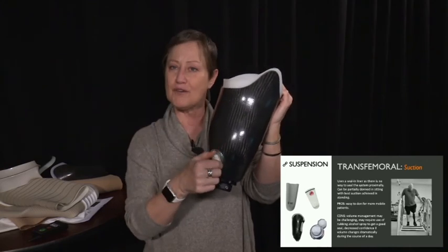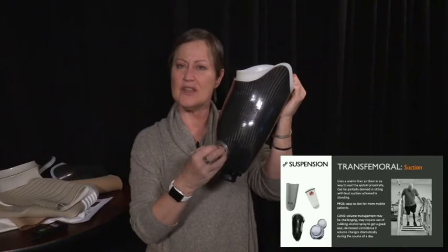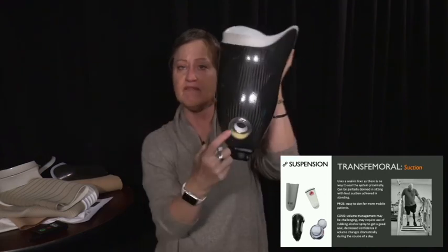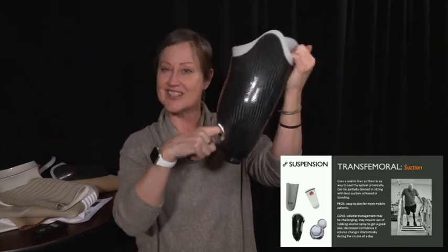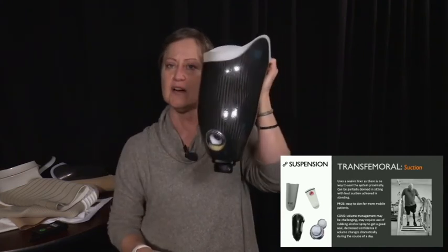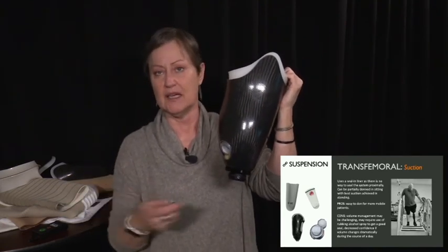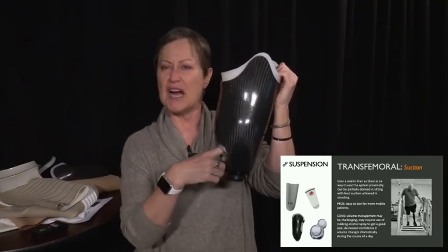For us, for therapists, and also for the patient, if they can't tell if they're already all the way down in the socket, when they're standing, you can remove this valve. Now you have a window. You can look in there and see, are they all the way down in there? You can reach your finger in there. Is there any space? The patient can do the same thing. If they're comfortable in standing, they have to have their body weight on the leg. They're going to reach over, take this off, reach in. Am I all the way down in there?